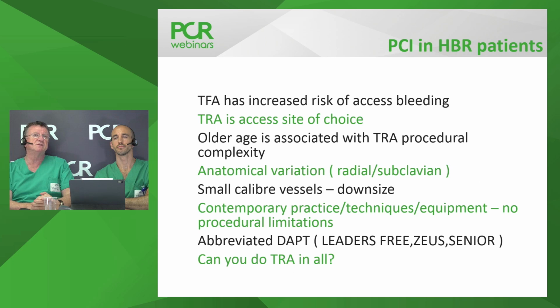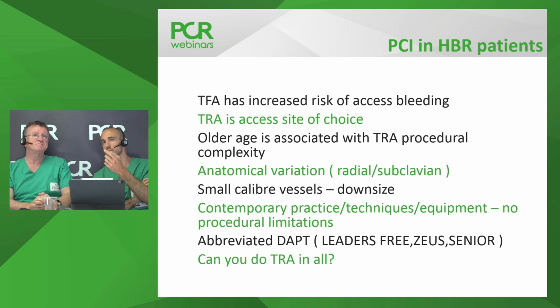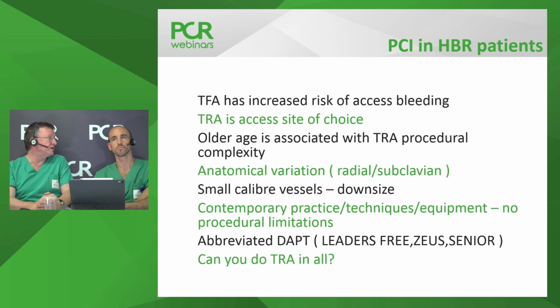But do you have any comments about that? In that particular case, I don't think it's a radial access issue. There was no issue with support. Yep. But in this case, you don't have more support in femoral access, no. Sometimes people who are committed femoral operators will maintain that guiding catheter performance is compromised for radial cases, but it isn't. It's a matter of selecting the right guiding catheter.